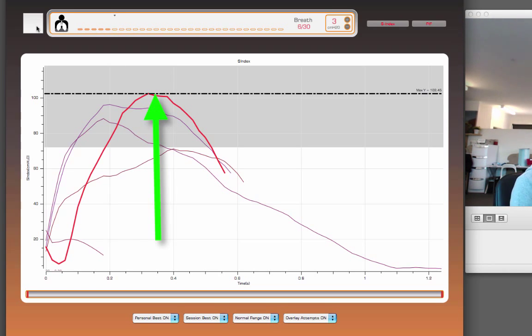Yep. So you are getting better every go, so one more go. Hopefully it's only one more go and we'll get a nice consistent run. I think you're hitting your max now. So all the way out.